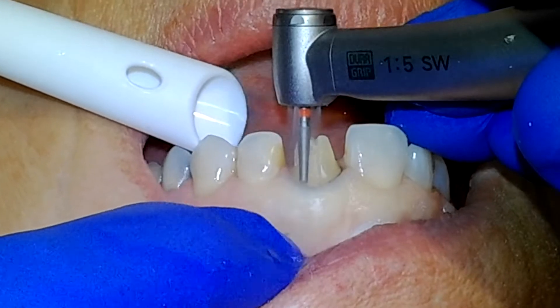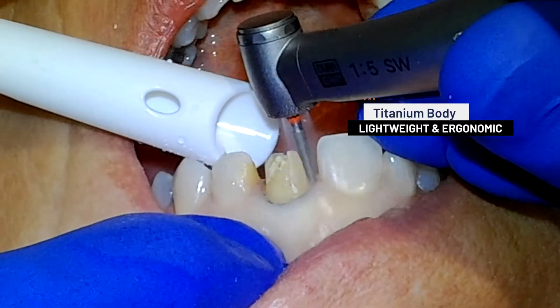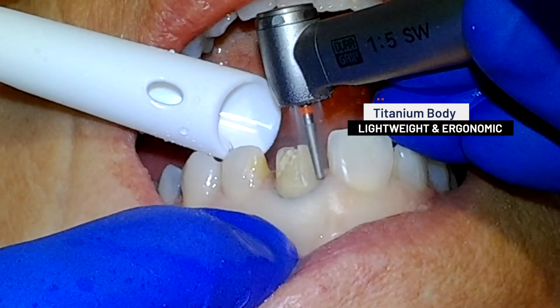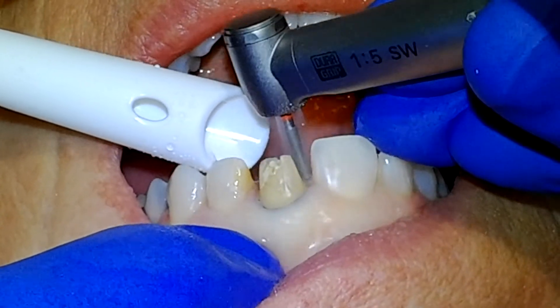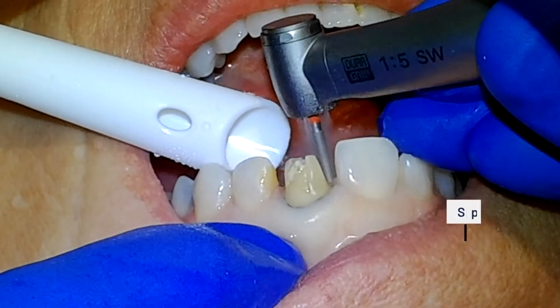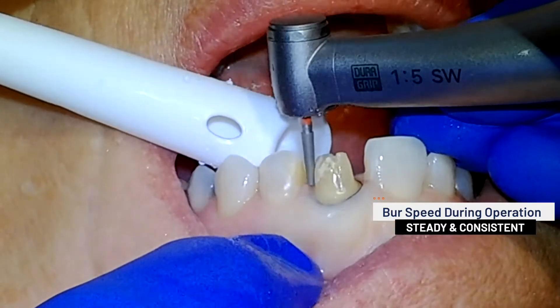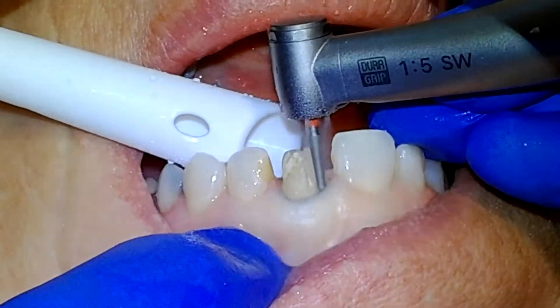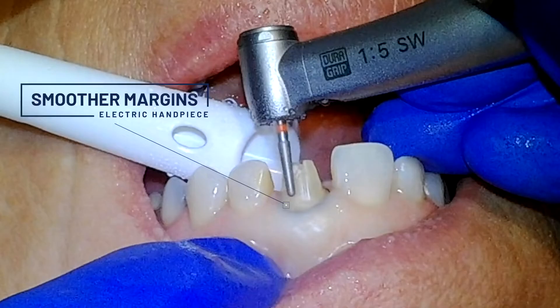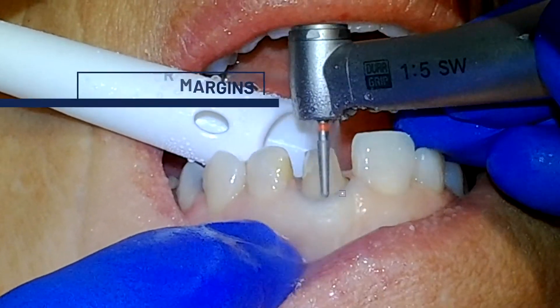Throughout the course of high precision procedures, the lightweight titanium body and DuraGrip coating on the Z95L help to eliminate hand fatigue. First time users of the Z95L electric handpiece will immediately notice how easy it is to maintain a steady and consistent speed of the burr during operation. Because the burr doesn't wobble and vibrate during use with an electric handpiece, the resulting margins of your preparation will be much smoother.